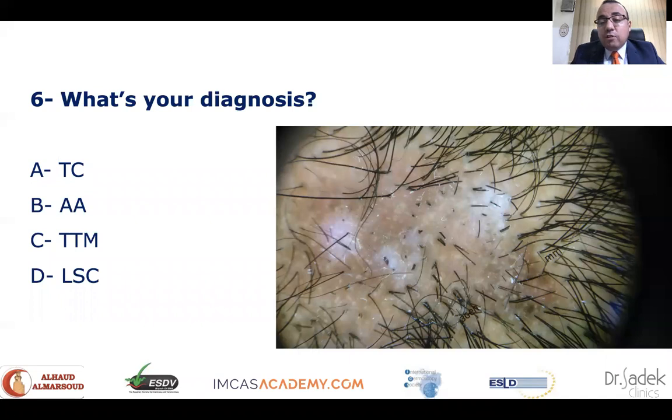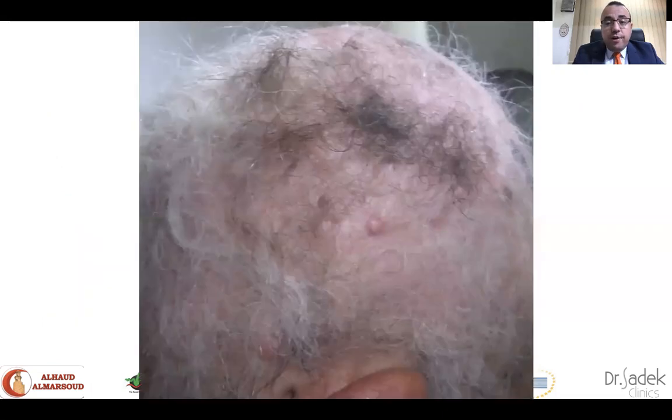there was thickened skin over there with prominent follicular ostia, and dermoscopically, this was violaceous in color, with some whitish lines as seen over here, secondary to chronic rubbing of the skin, leading to lichenification. And yes, this is a case of lichen simplex chronicus that manifests exactly by these patterns, in addition to sometimes some perifollicular scales. Very well.